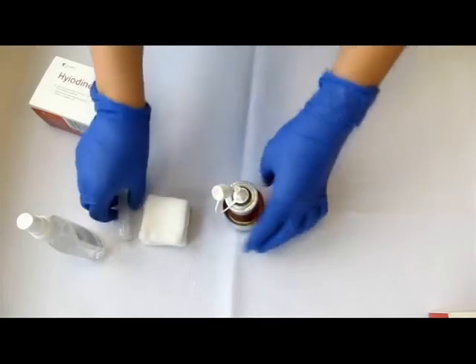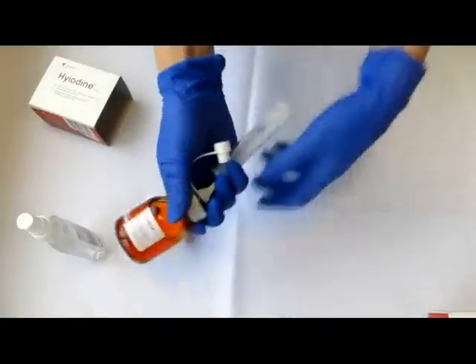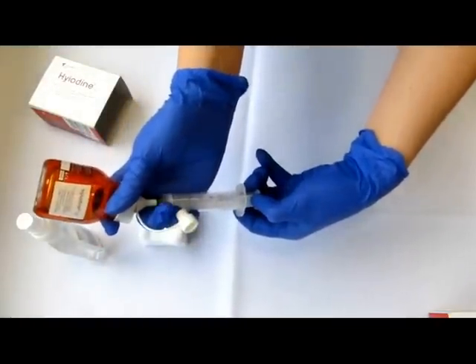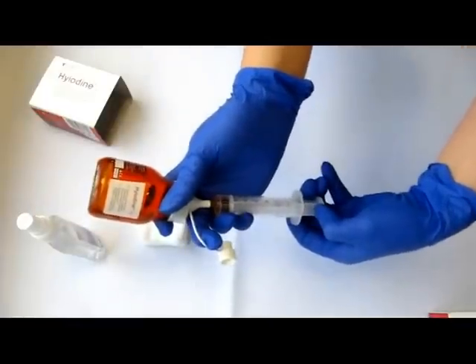Open the spike and insert the syringe inside. Turn the bottle up and withdraw the needed amount of gel into the syringe.